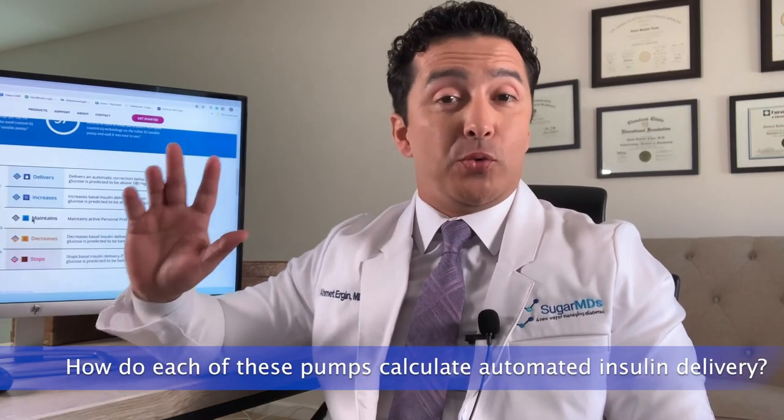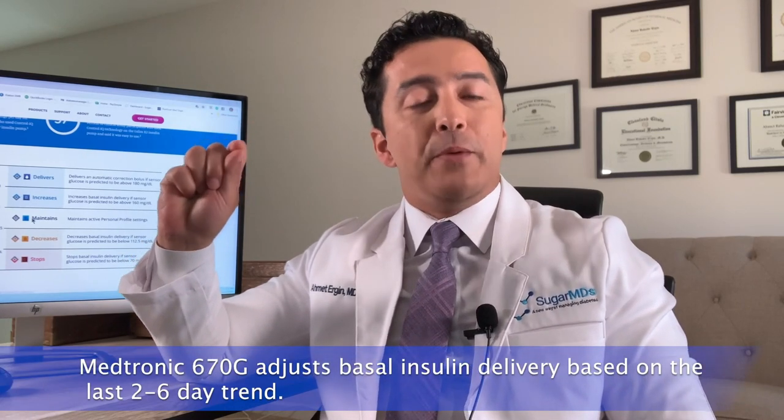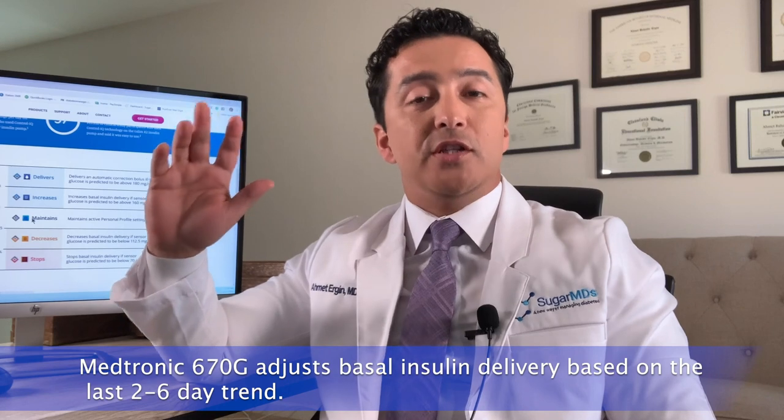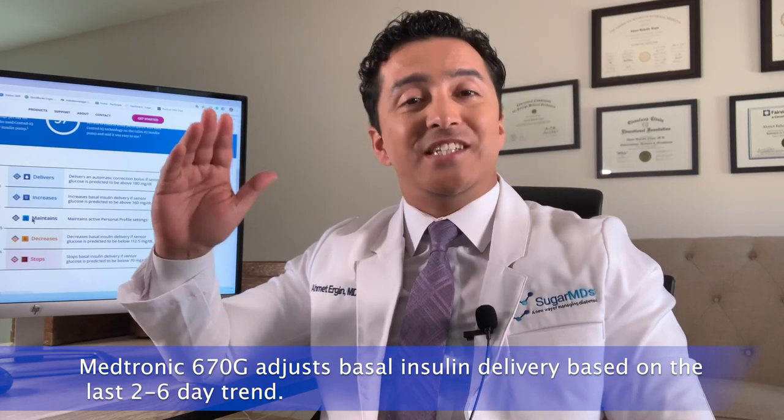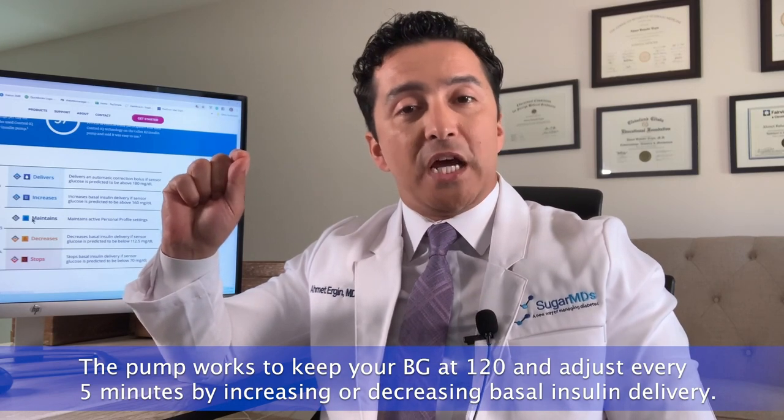Let's talk about how these pumps calculate automated insulin delivery. There are major differences. Both are closed loop systems, but here is how they differ: the Medtronic insulin pump adjusts your basal insulin delivery based on the last two to six days. The pump actually learns from recent days of basal delivery and adjusts every five minutes to try to keep you at 120 mg/dL.